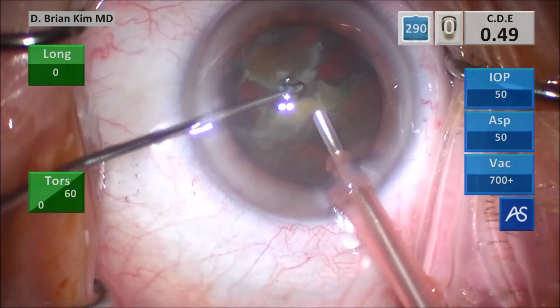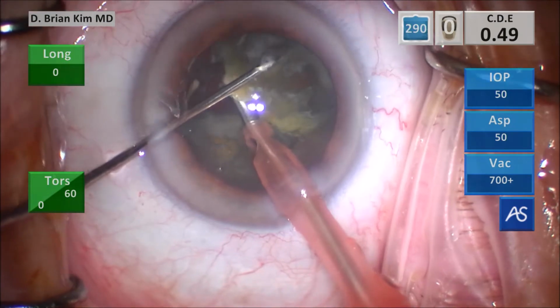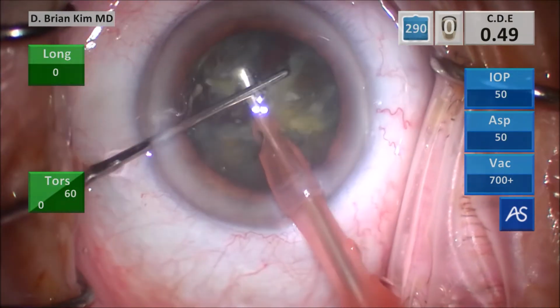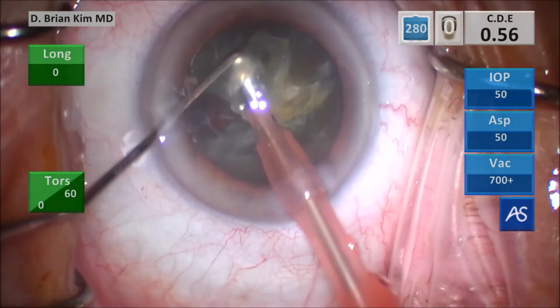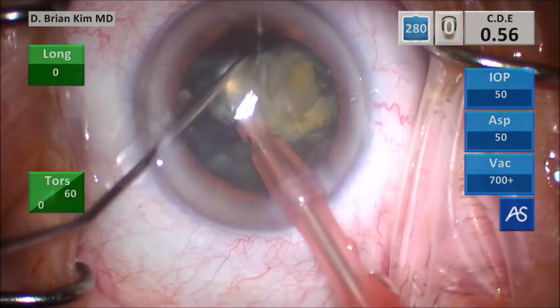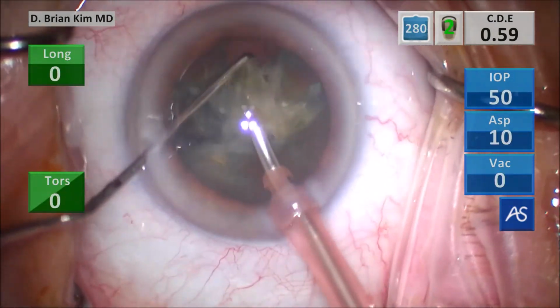So we're going after the second quadrant, placing the chopper around the lens, placing the phaco tip deeper, carefully, slowly, dividing it, separating it, grabbing it with a little bit of vacuum, pulling it up, crushing it again, dividing it, crushing it again. I keep crushing the pieces until they're small enough, and then I emulsify the lens pieces.